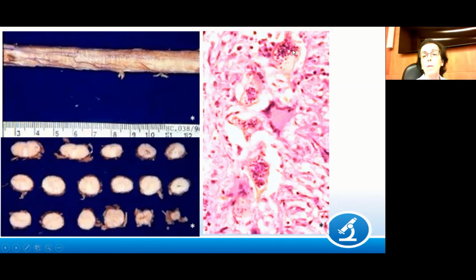And histologically it was full of ova inside giant cells. And they have a typical spine here. Depending on the location of the spine, it can be one of the species. The Mansoni has a lateral spine.